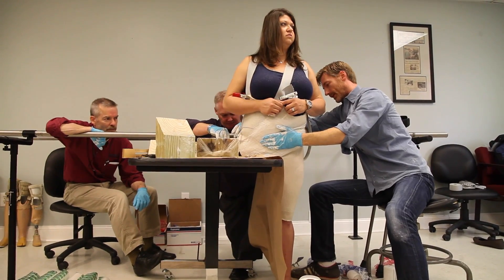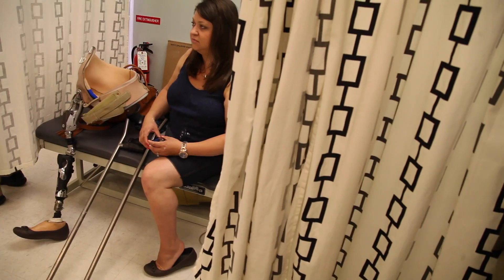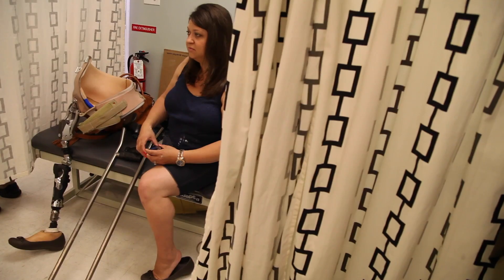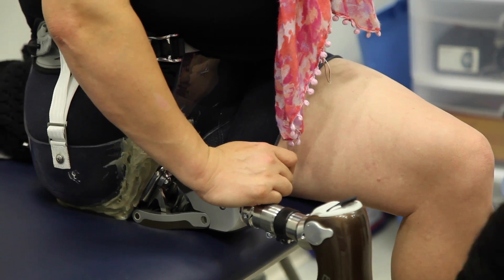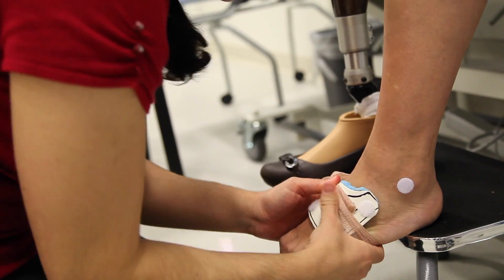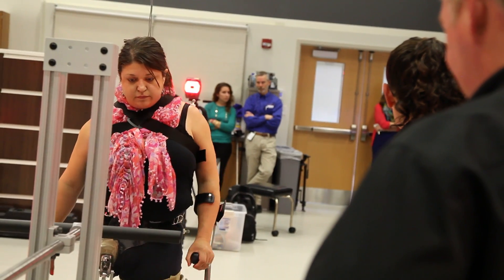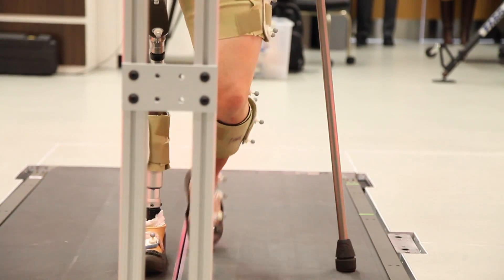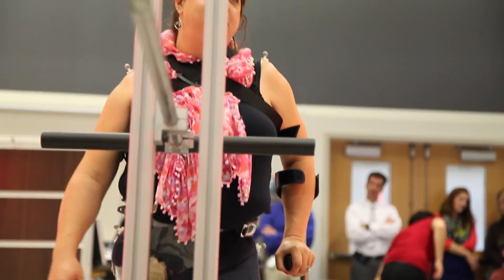We got involved working with Ashley and going through the typical procedures, but we were still falling short of her expectations. Her goal was to walk without use of a forearm crutch. Eventually we went down to the University of Delaware with the Bader department, and utilizing motion capture analysis, we were able to compare her existing prosthetic with what we currently made for her. There were still some things we couldn't clinically figure out. I kept hearing, "You're working like a man and doing things women shouldn't be doing." And I said, "What would you tell me if I were a man? There's got to be some technology that I can be as active as I want to be without breaking it."